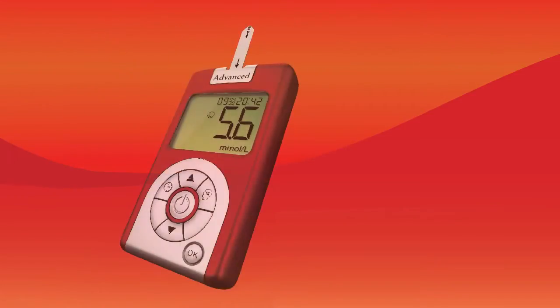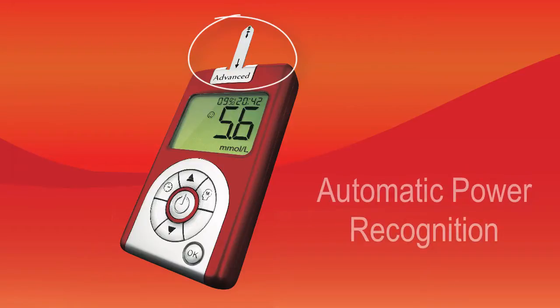The iCare Advanced Meter turns on automatically once a strip is inserted and guides you through the testing procedure, with a large display to simply see your results.